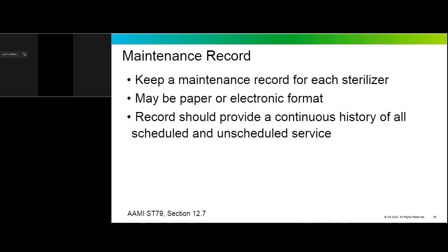Maintenance records, just like you might have a file on your vehicle for all the maintenance, similarly you should be able to produce a maintenance record or log for every sterilizer at your clinic or surgery center. This could be in paper or electronic format, and it should provide a continuous history of all the maintenance that's done, whether it was scheduled or unscheduled service.